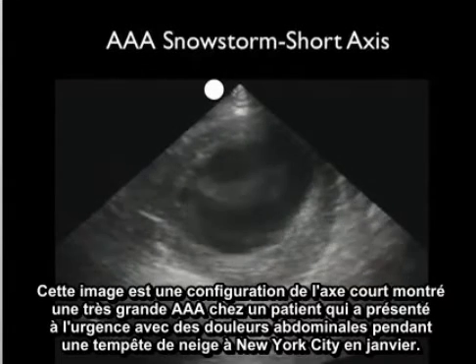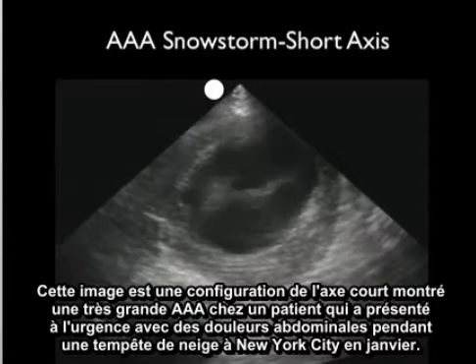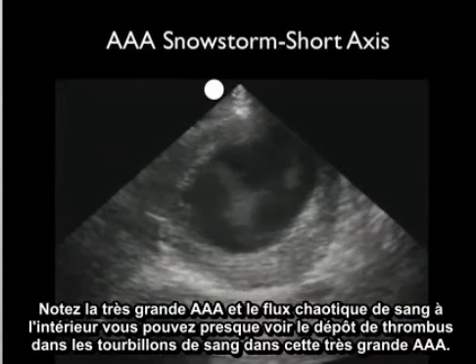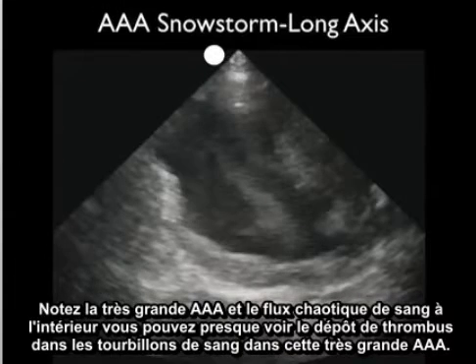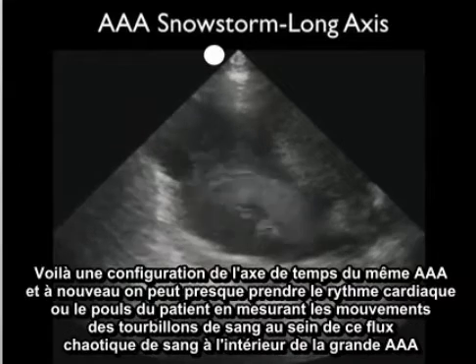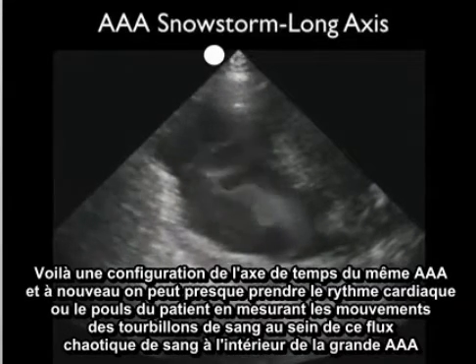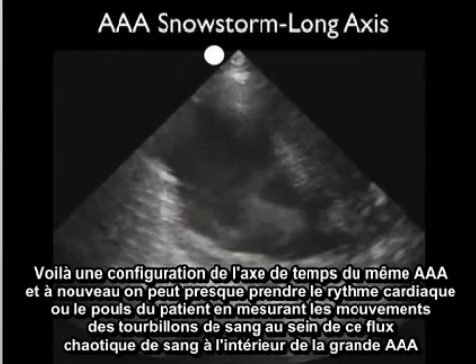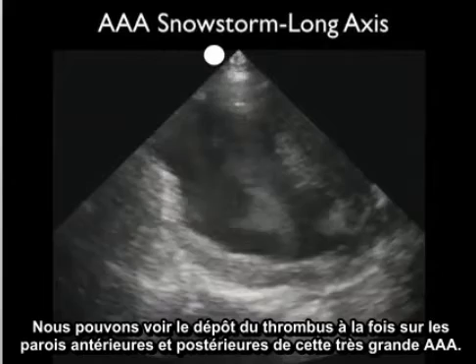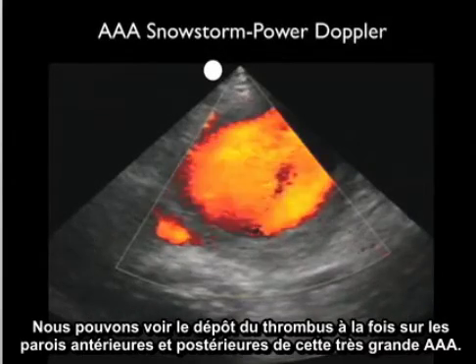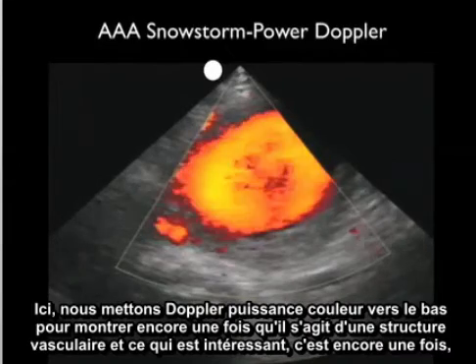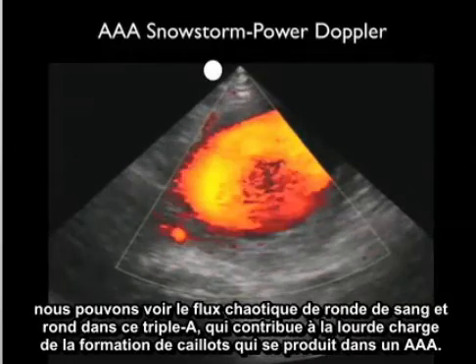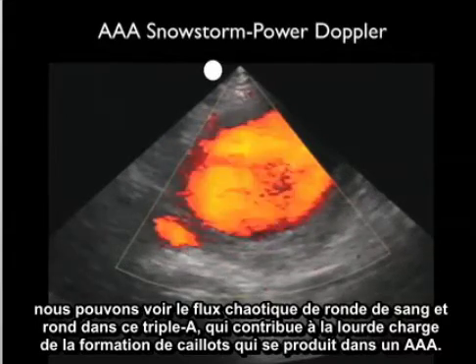This image is a short axis configuration showing an extremely large triple A in a patient who presented to the ED with abdominal pain during a snowstorm in New York City in January. Notice the very large triple A and the chaotic flow of blood inside — you can almost see the thrombus deposition from the swirls of blood. Here's a long axis configuration of the same triple A, and we can almost take the patient's pulse by measuring the movements of the swirls of blood within this chaotic flow. We can see the deposition of thrombus on both the anterior and posterior walls. Color power Doppler again confirms this is a vascular structure, and shows the chaotic flow of blood contributing to the substantial burden of clot formation.